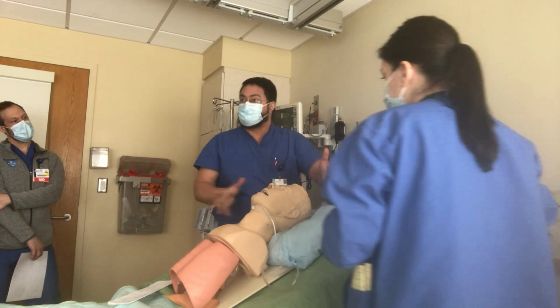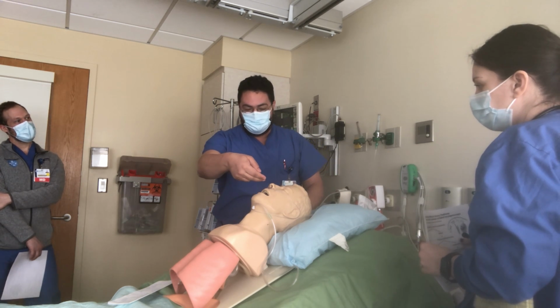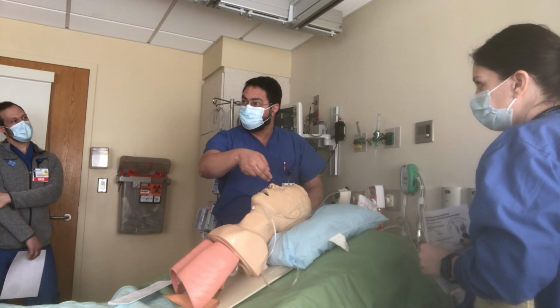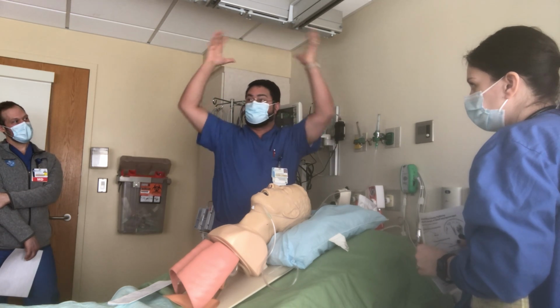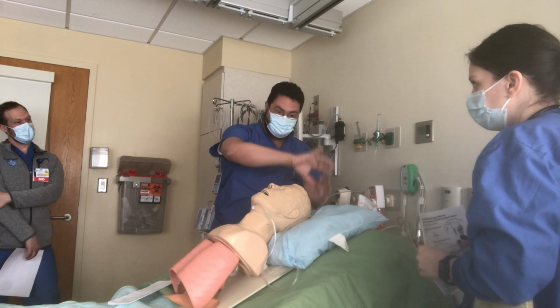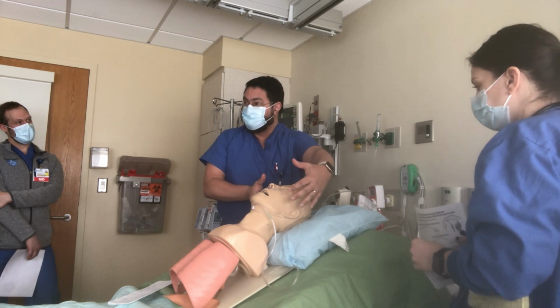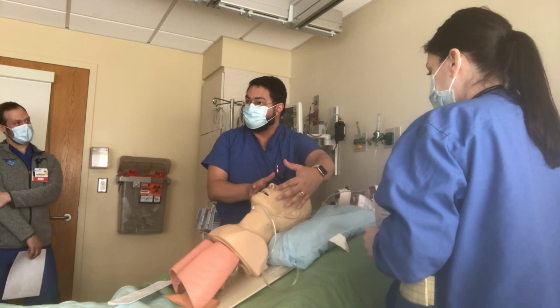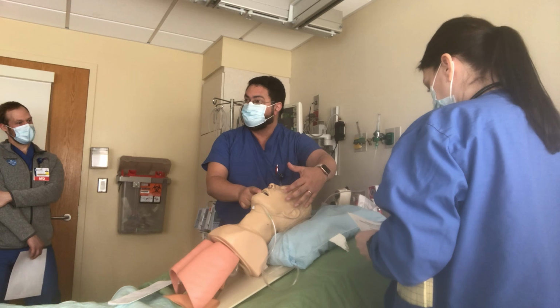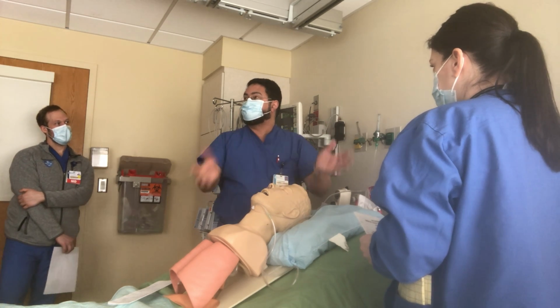It will give you the Jesus effect. The patient will look like Jesus because the oxygen is going to fill the nose, the nasopharynx, the oropharynx, the mouth. It's going to come out of the mouth and make a halo of oxygen around the patient. If you have a Geiger counter and this is radioactive oxygen, it will look like Jesus. And anywhere the patient is breathing, even if he opens his mouth and doesn't breathe from his nose, he's going to have 100% oxygen. So that's very important in the beginning.